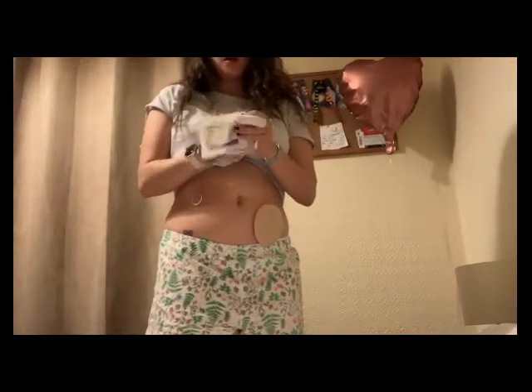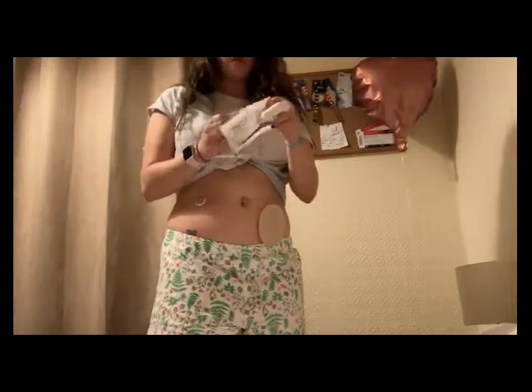But these are fantastic. They stop it coming off, stop it peeling and stuff, and I think they're only like 20p each to buy, but I get them on prescription. My doctor's kind enough to do that for me, and because they're only like 20p, I think most doctors will do that for you if they explain the reason behind it. So yeah, it's just like a very thin layer of sticky plastic.